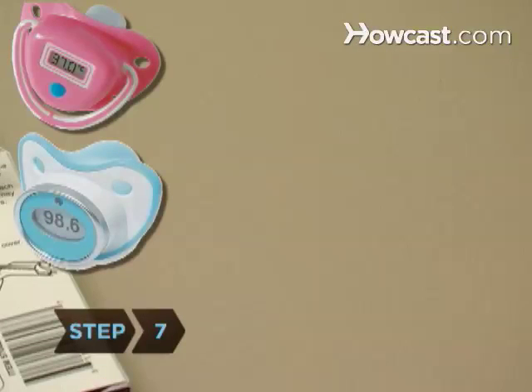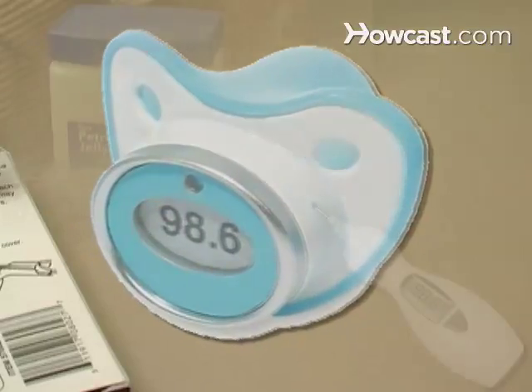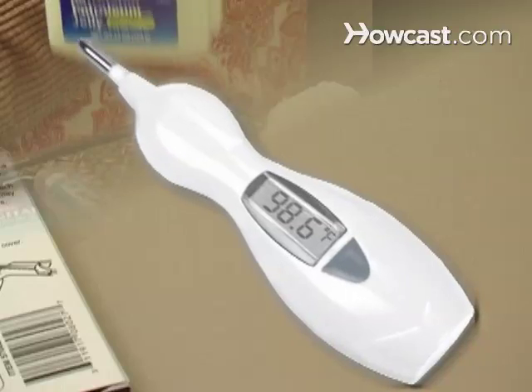Step 7. Use a pacifier or a rectal thermometer for babies. With the pacifier, let the baby suck on it. For rectal, lubricate the thermometer with petroleum jelly and insert a half inch to one inch into the rectal cavity.